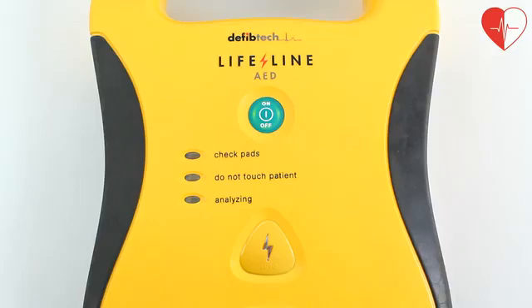Call for help. Remove pads from package in back of unit. Apply pads to patient's bare chest as shown. Analyzing heart rhythm — do not touch the patient. Shock advised. Charging. Stand clear. Stand clear. Shock advised. 3, 2, 1. Shock 1 delivered. It is safe to touch the patient.